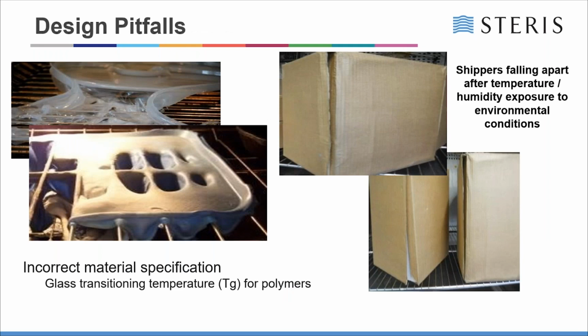Again, as a worst case, you'll see design pitfalls, again looking at that glass transition point not being known, or the melt point for the actual products there on the two pictures on the left-hand side. It took longer to actually clean out the chambers after doing the testing than it did to actually cause the melting of the product in the first place.